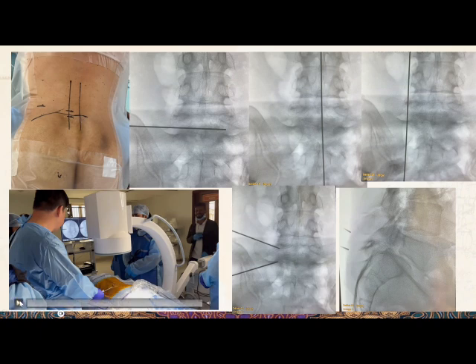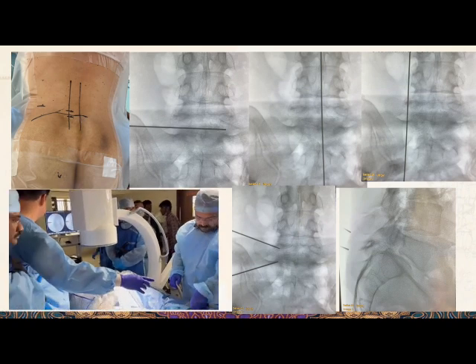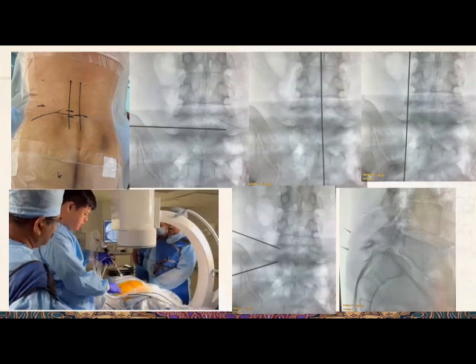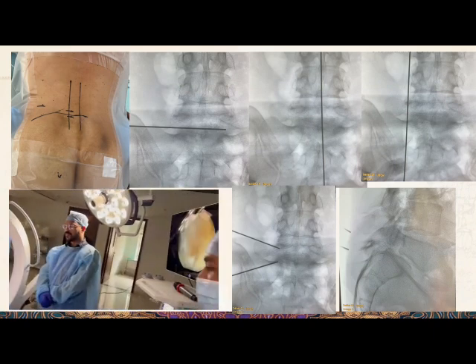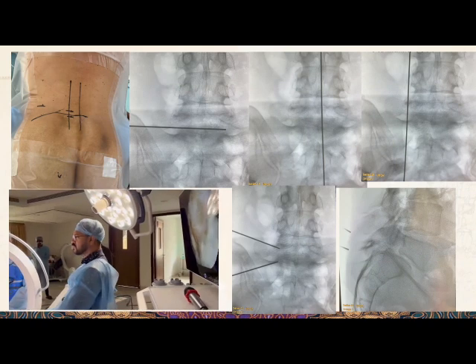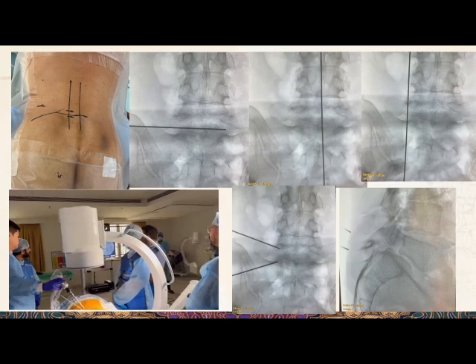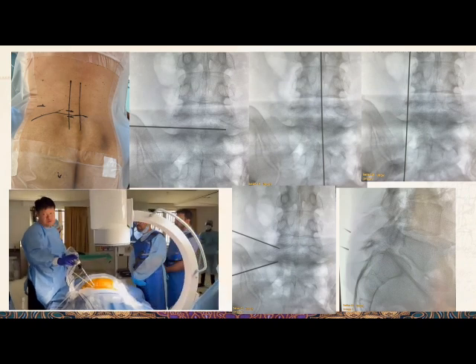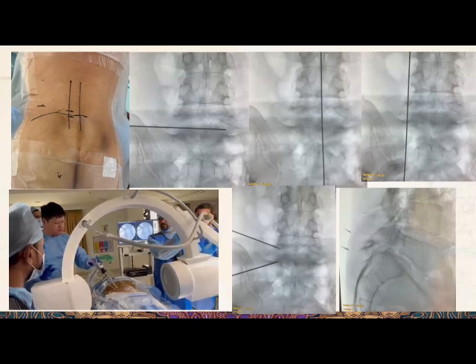This is a setting done in Brunei, but very similar to actual practice. We have the patient marked, first identifying the correct level. I would take a lateral view to ensure the endplate is perpendicular to the ground as far as possible, then mark the midline and lateral perpendicular line. On the left side, the portals are slightly higher at the upper pedicle of L5; on the right side, at the lower pedicle of L5-S1.